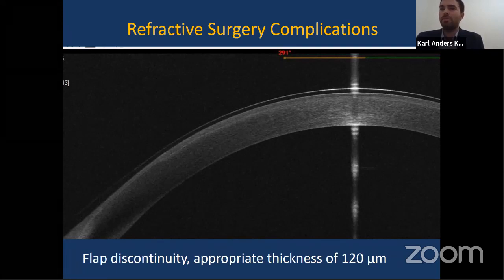And we were thinking of different techniques. Possibilities were PRK, trans-PRK, but we decided that we could push the limits of the technology and think about even performing a deeper flap. We also obviously researched a lot of different options, and we'd seen a nice paper by Diane Reinstein, who had used Artemis high-frequency ultrasound to measure the flap thicknesses and allow creating a second, deeper flap, with a really high safety profile.